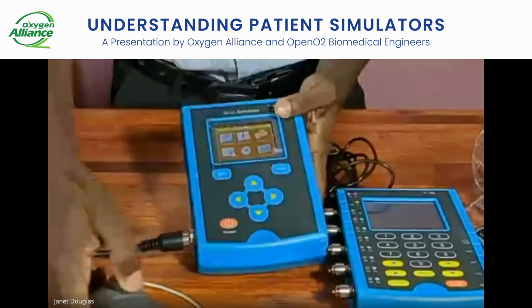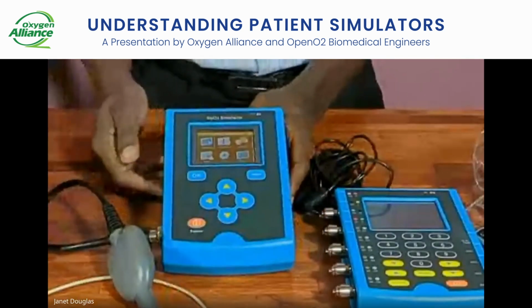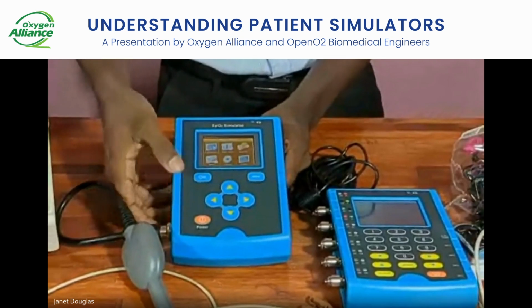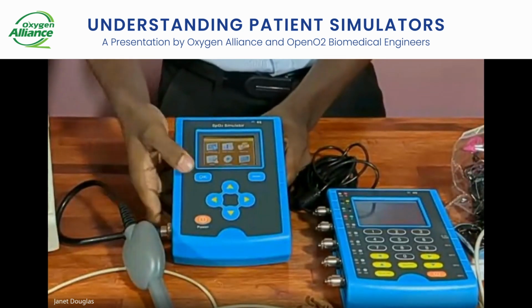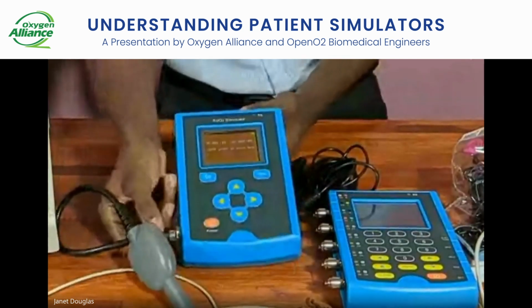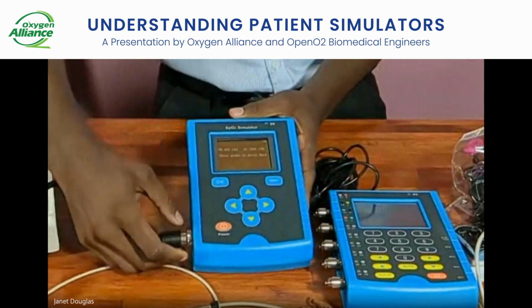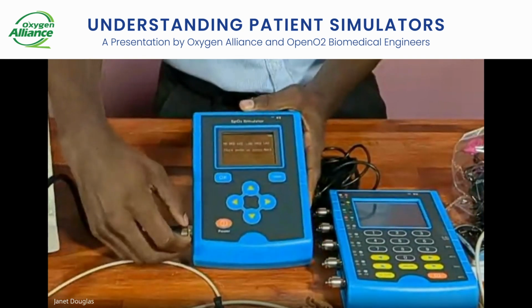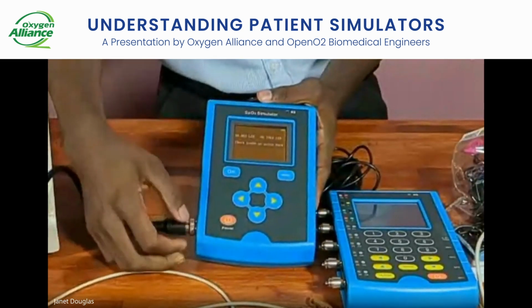So we have our probe connected now. We're going to go into the simulations so that we can see the types of simulations that are there. You use the arrows for navigation. We are already selected on the simulations. You click OK, and it's showing that. So this is one of the problems that I was saying. You need to make sure that the probe is connected properly.